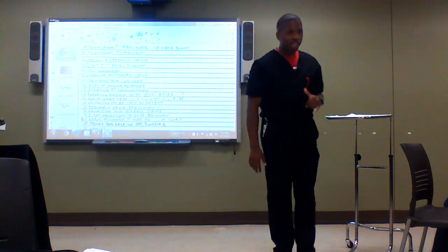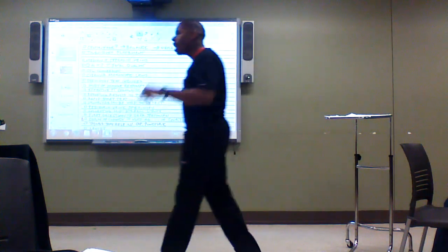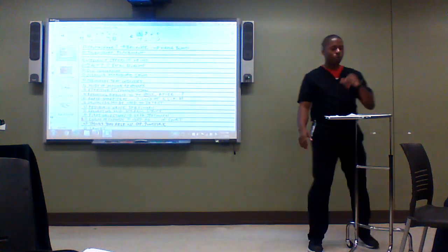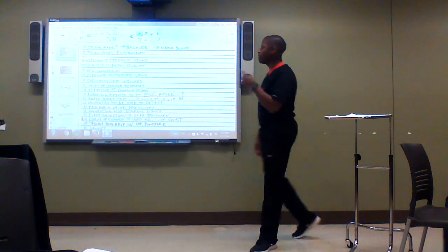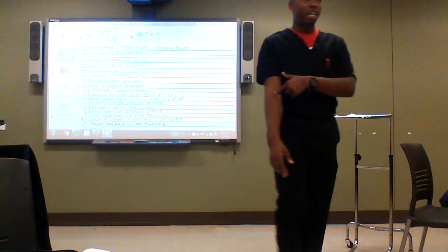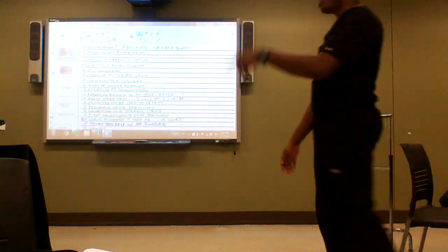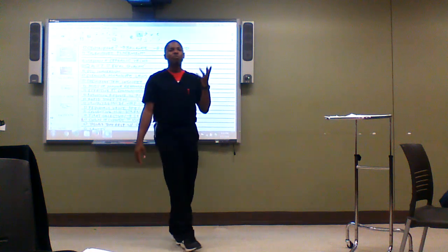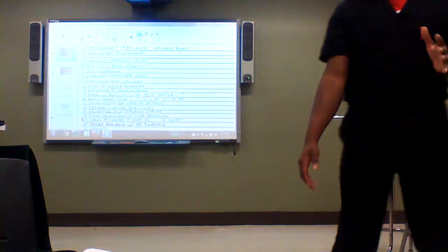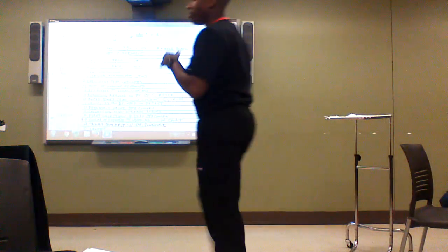But particularly when we talk about what vein we want you to use, we want you to go for this specific one. Once again, I already told you this, the median cubital. Then our secondary is going to be cephalic. The reason why we really don't want you to use the basilic unless you have to is because the basilic is known for rolling.